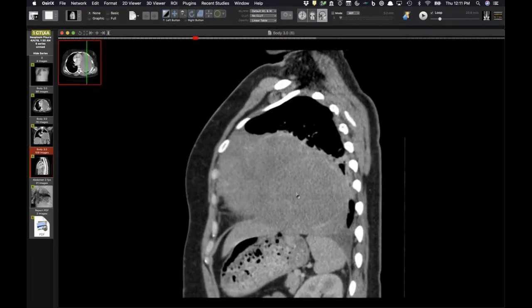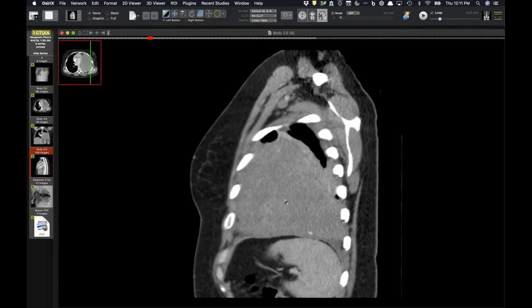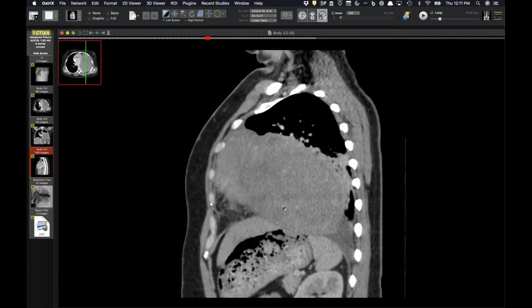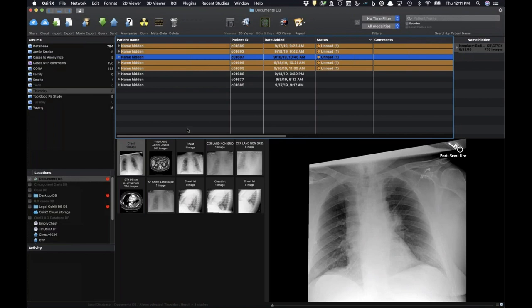Just the appearance of it before I registered the age is what suggested it to me. Big and bland. Yeah, I agree, it's very uniform. Sometimes we see fibrous tumors with calcium and other heterogeneous areas, but I think that's probably the best thing it has going for it. Inflammatory myofibroblastic tumor is something else to think of when you see a large lesion in a young person.